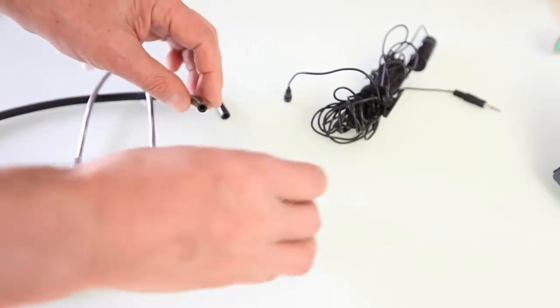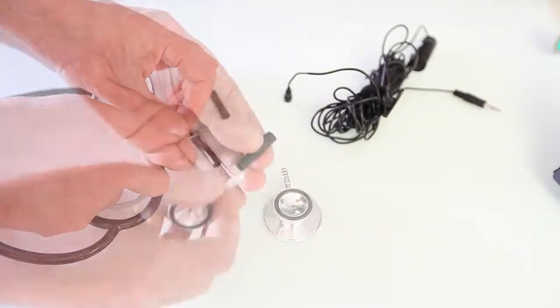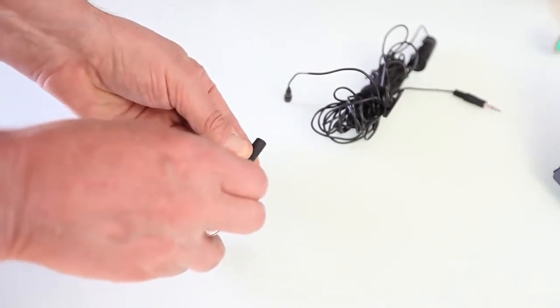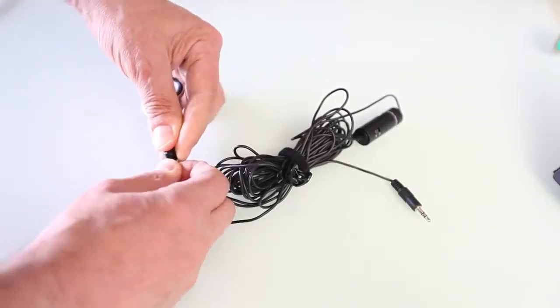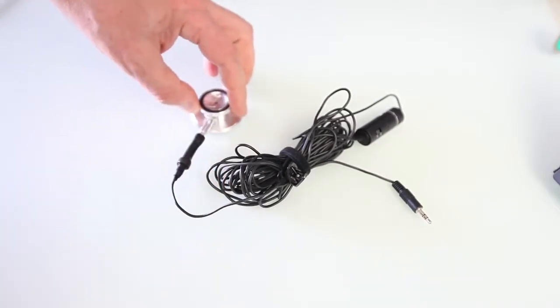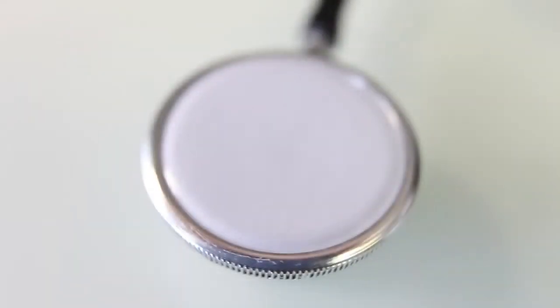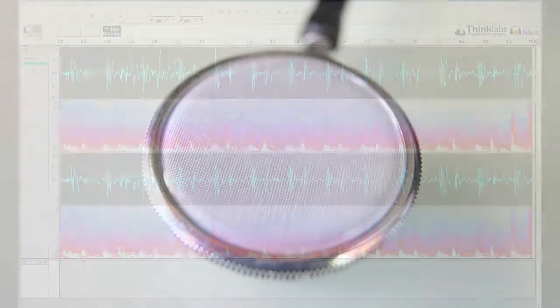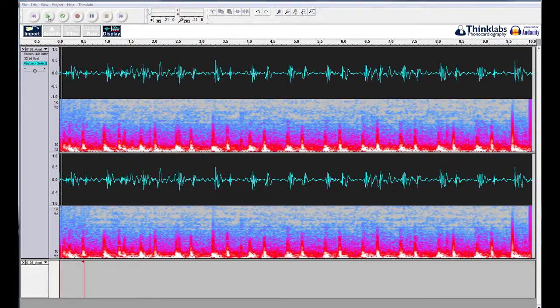We will attach the microphone to the chest piece of the stethoscope using a short piece of tube. The bell part of the stethoscope will be used for recording; the diaphragm can also be used. In an ordinary acoustic stethoscope, the diaphragm is used to filter low-frequency sounds and to emphasize high-frequency sounds at the expense of their amplitude. However, in our case, we can use software to amplify various frequencies and to remove some unwanted high frequencies.